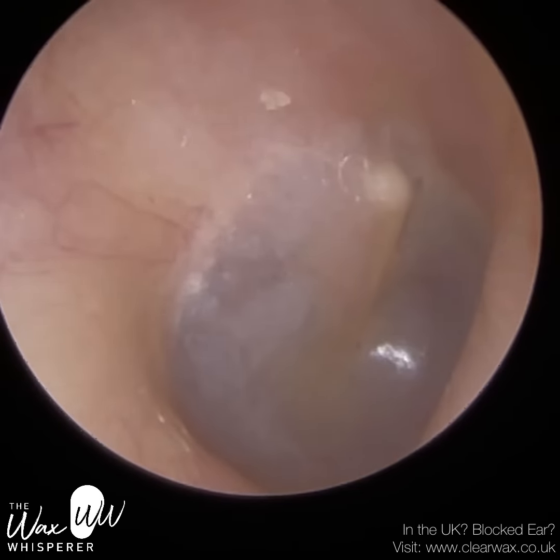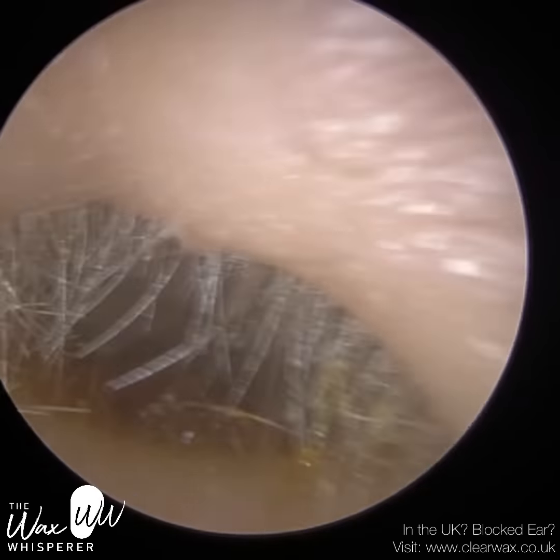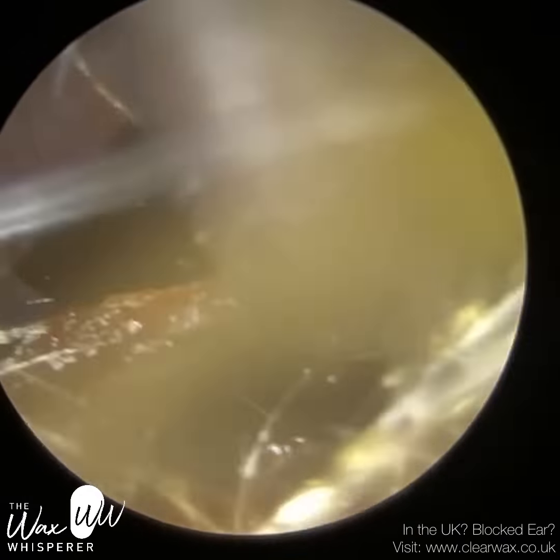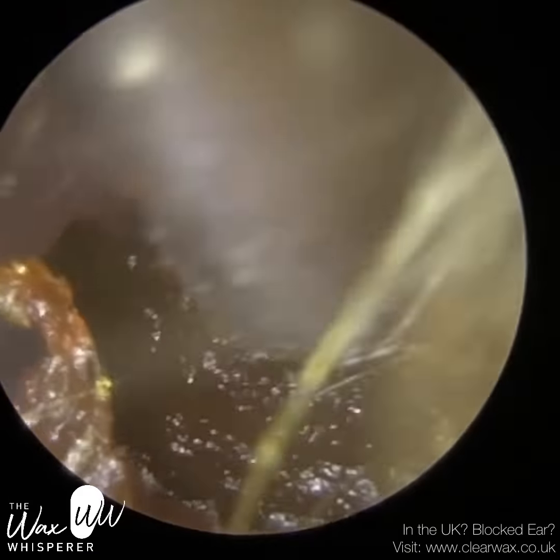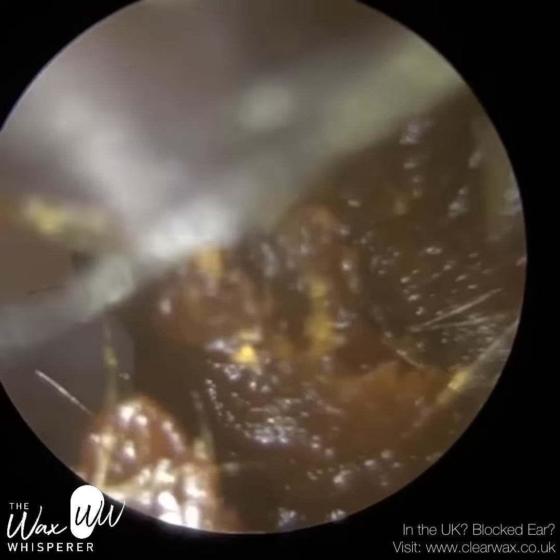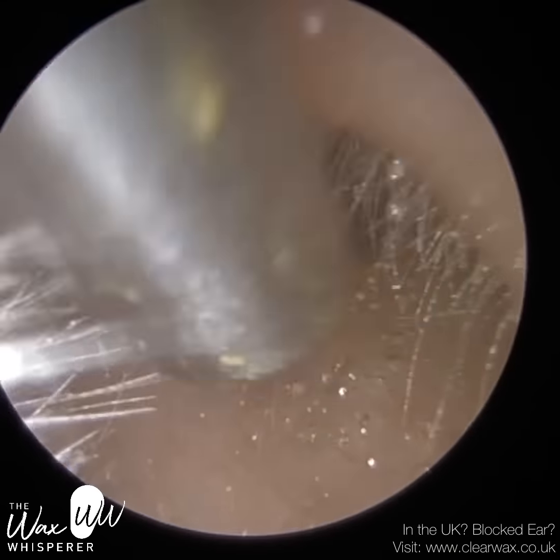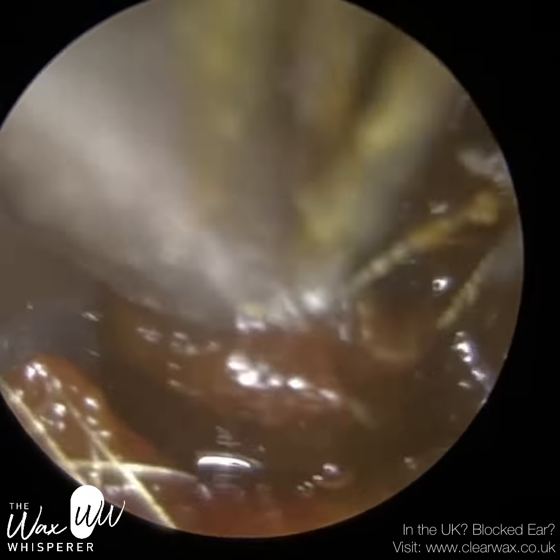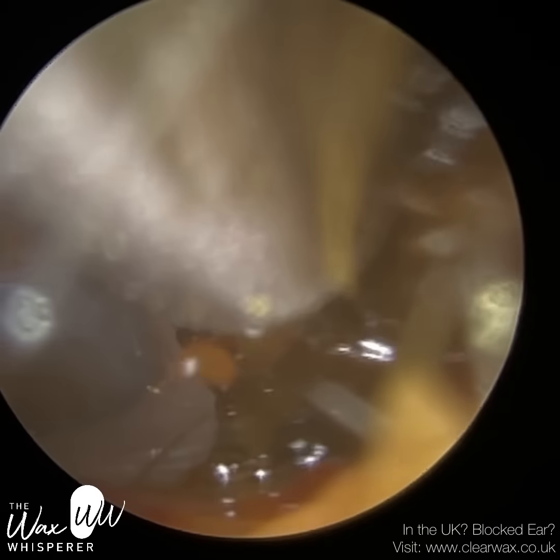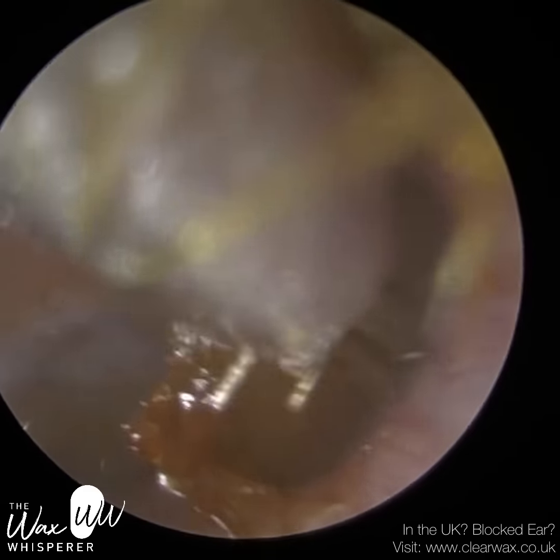The reason we want to avoid the bony part of the ear canal is because it's very, very sensitive. The cartilaginous portion — the outer third — is made of cartilage, it's flexible, and I wouldn't say it's completely insensitive, but it's semi-sensitive. Whereas the bony part of the ear canal is rigid, very sensitive, and not malleable in any way. The skin lining the outer cartilage portion is about a millimetre in thickness, whereas the skin lining the bony part is far, far thinner — almost 10 to 15 times thinner, so less than 0.1 millimetres. And that skin is directly attached to the bone with no fatty tissue to buffer it. So if you come into contact with the bony part, it can be uncomfortable for the patient.